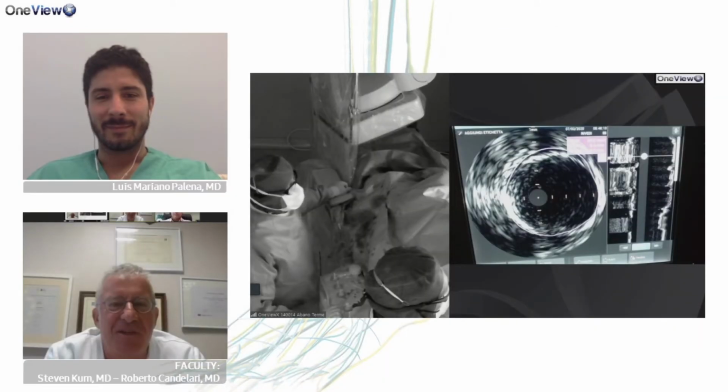In the meantime, we were not able to cross the 80, but for sure we will have a good opportunity to assess that lesion there, in the popliteal artery. Why can't it be seen now when it was visible before? Sorry, we have to shift with the camera. Yeah, I know. Okay, but we can comment just now.